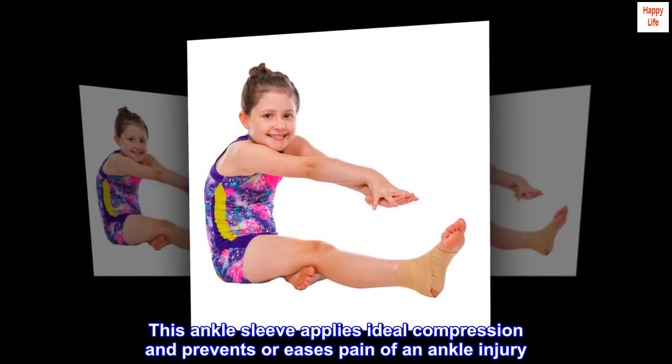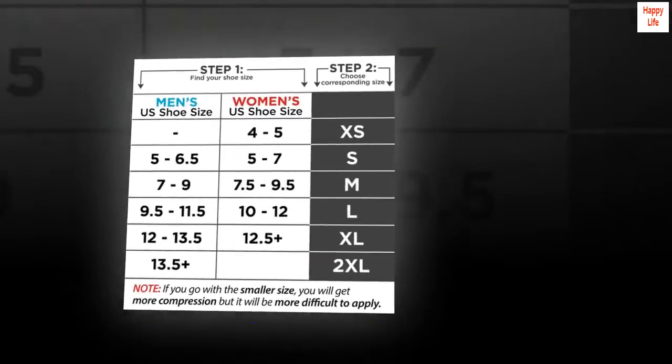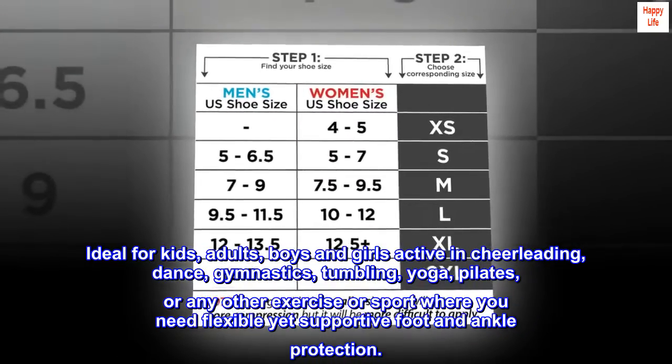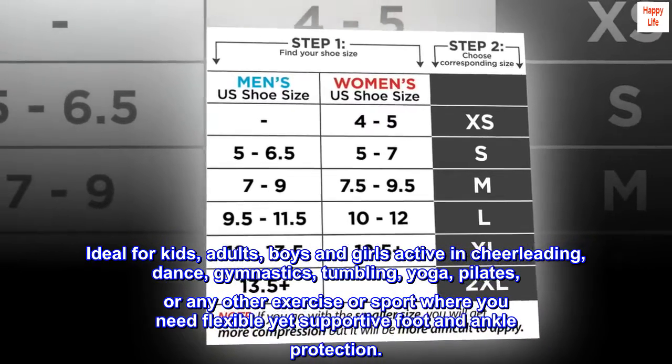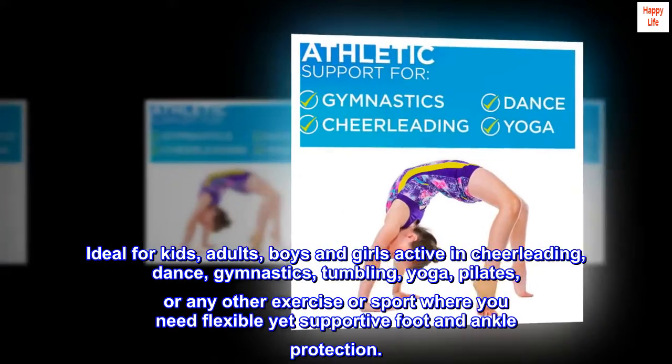This ankle sleeve applies ideal compression and prevents or eases pain of an ankle injury. Ideal for kids, adults, boys and girls active in cheerleading, dance, gymnastics, tumbling, yoga, pilates, or any other exercise or sport where you need flexible yet supportive foot and ankle protection.